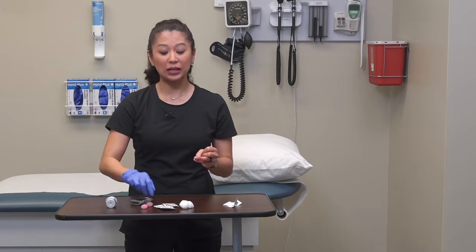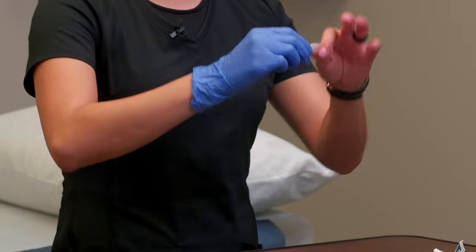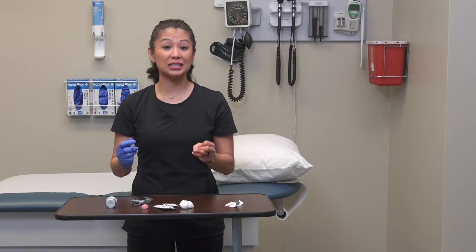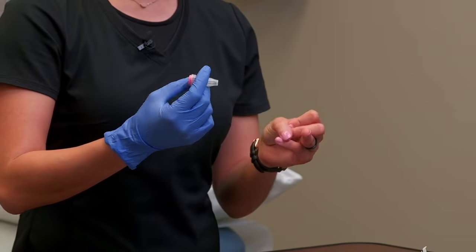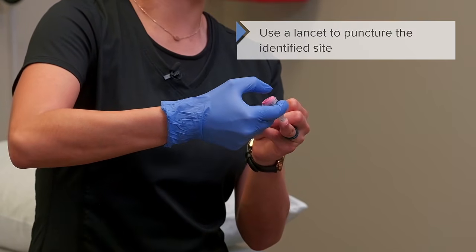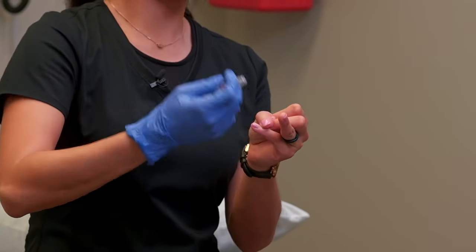Now just know each facility uses a little bit of a different lancet. So this one, I'm gonna take this out. Make sure you get familiar with your lancet because again, each one of these is a tad bit different. So I just pulled off the stopper here. Then I'm gonna take my lancet, push it towards the pad and keep a little pressure here. And then I'm going to push down the top. You're going to hear a click and puncture the site.